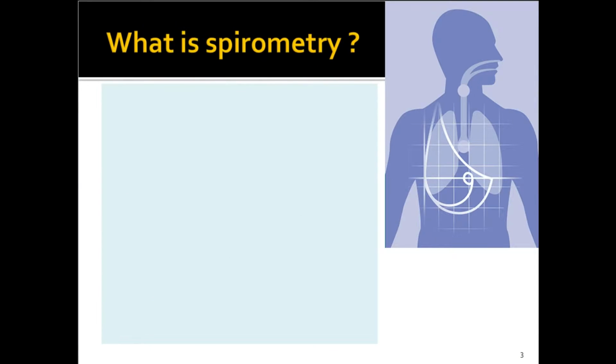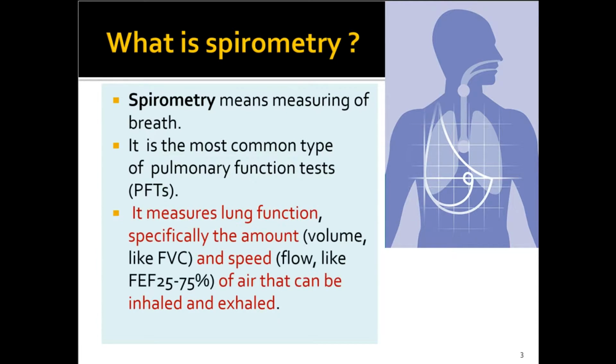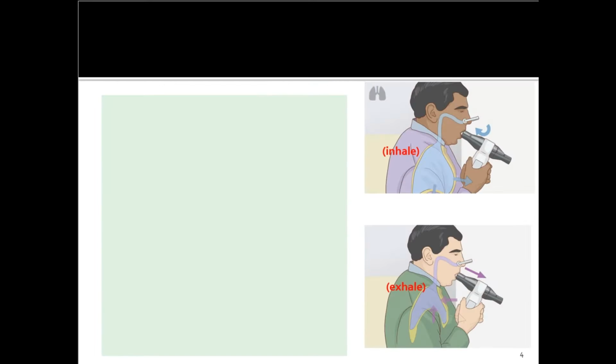What is spirometry? Spirometry means measuring of breath. It is the most common type of pulmonary function tests. It measures lung function, specifically the amount, volume, like FVC, and speed, flow, like FEF 25 to 75%, of air that can be inhaled and exhaled.